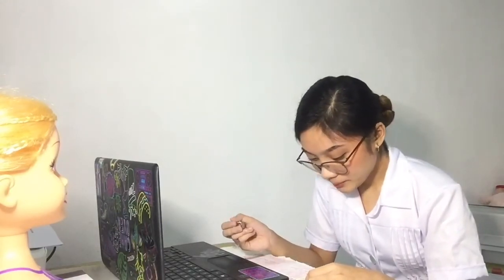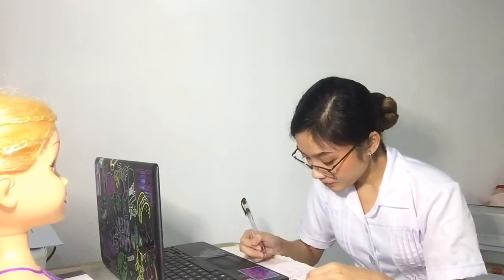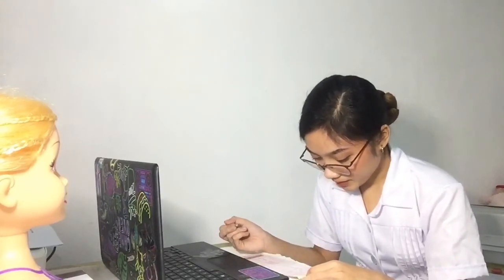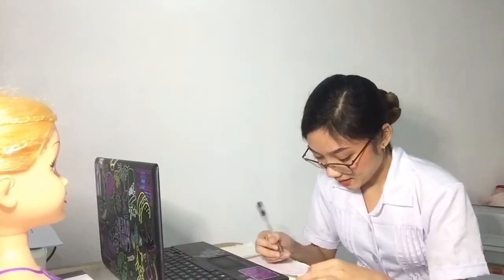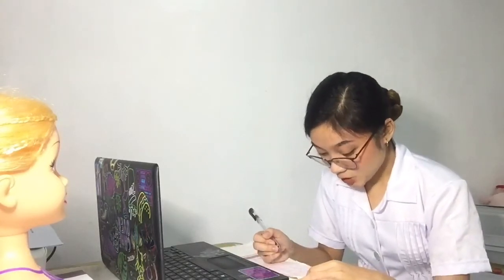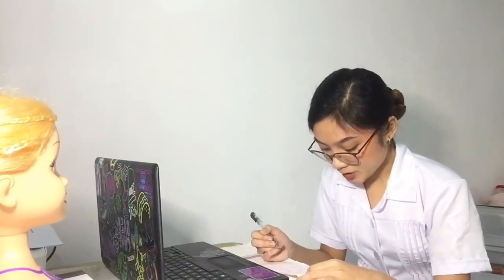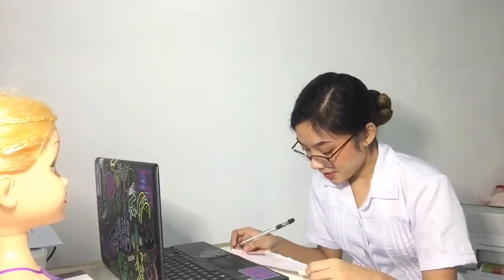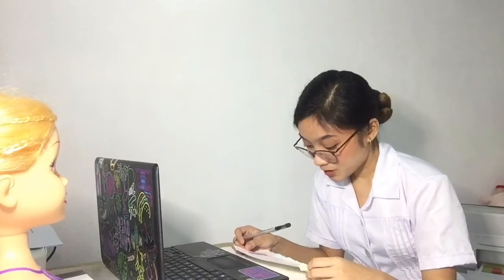with your basic information po: yung baby's last name, mother's first name, date of birth, time, sex, weight ng baby, date of collection, as well as the time, yung age of gestation, yung specimen, of course, the heel, yung feeding po, then yung place po, here sa clinic, okay, place of birth, the practitioner, and also the practitioner's contact number, baby status, okay, your guardian's name, yung address nyo po, yung street, yung number, barangay, and that's all po.